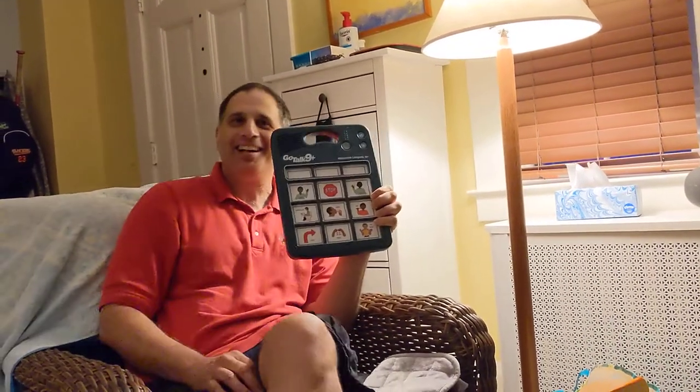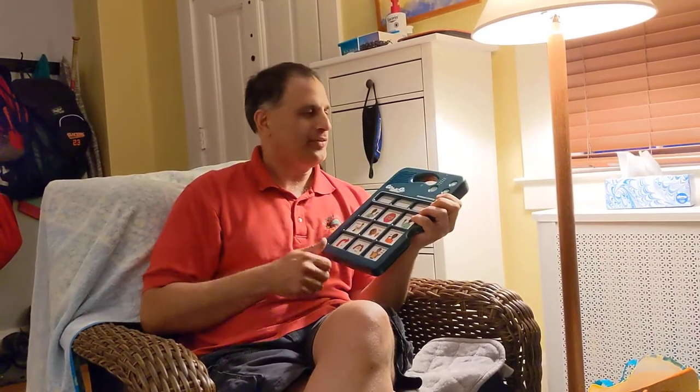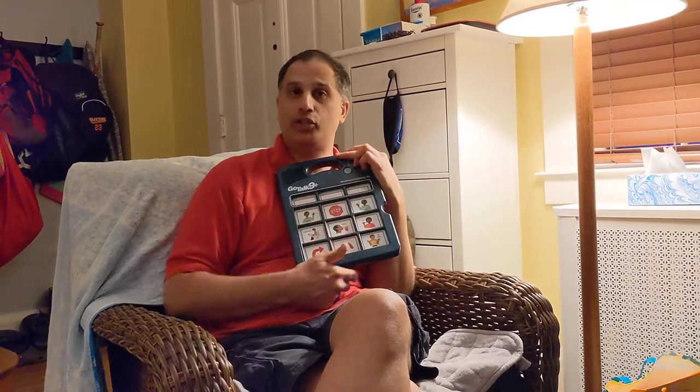Hello! Hi, I'm Mr. Mohan, the distanced SLP. This is another video about the GoTalk 9 Plus. I'm going to talk about a few more advanced things you can do with it if you need to reprogram some of the buttons — if you want the buttons to say different things, or you just want to change the voice on the buttons. I'm going to explain how to unlock it and do those things.